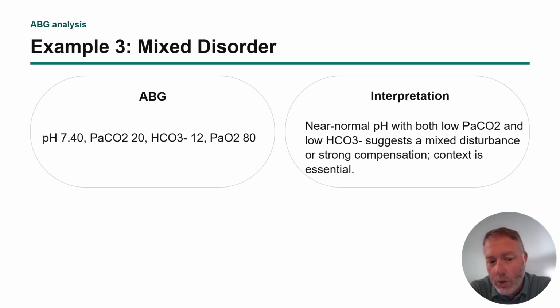But because it is low, what does that mean? It means there's a primary metabolic acidosis component, and the patient is trying to compensate with their breathing.